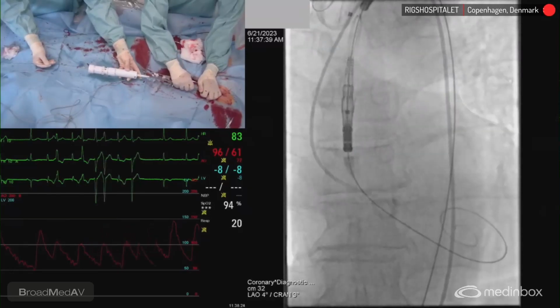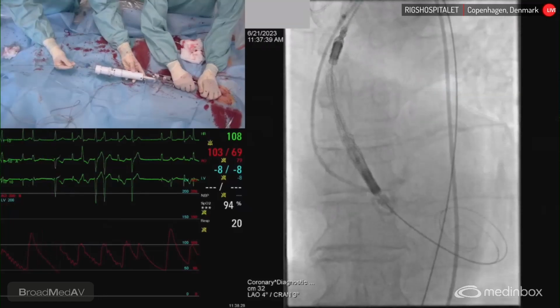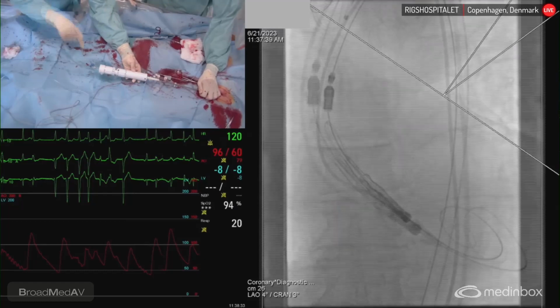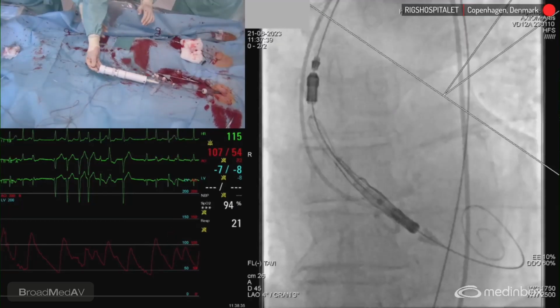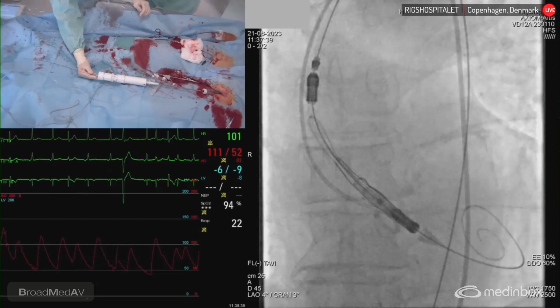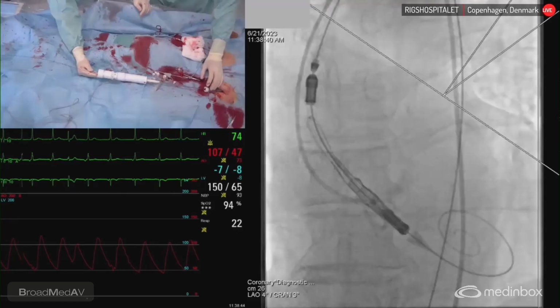Valve is correctly loaded. It's a good thing. Okay, I think I will step in if I'm here. We have to be very precise here, I think. Let's try to do that. Patient has to lay very still too. It's important. All right, good.